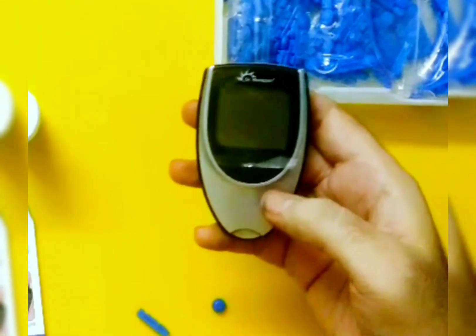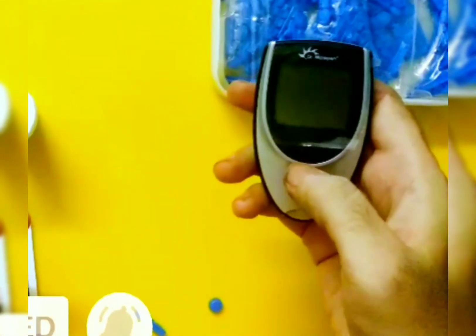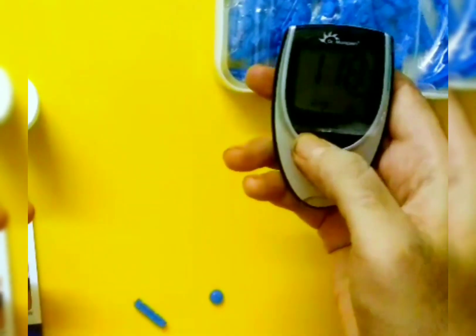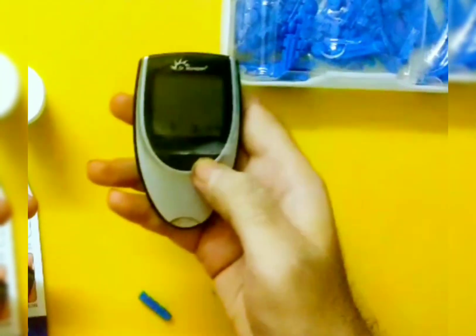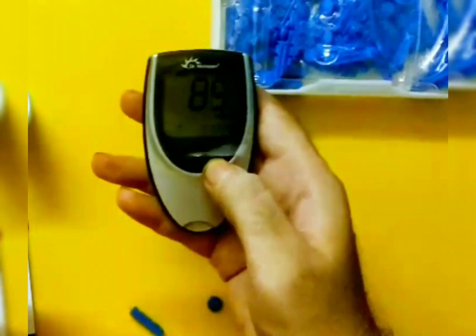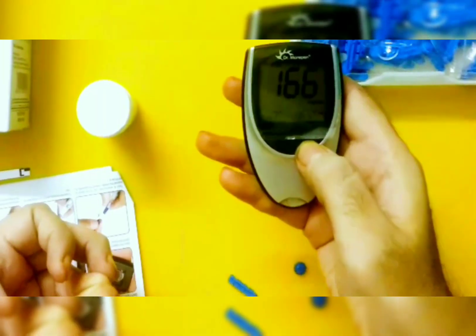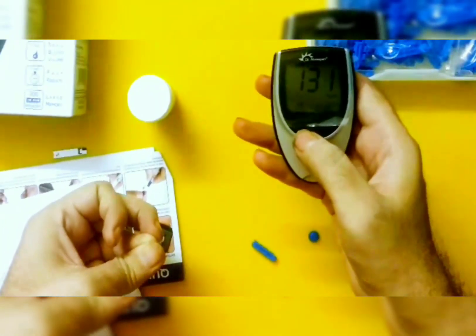We can refer to these results later on also. If I just press the memory button, it will show me the results: 118, 112 — that was the one I recently did — 95, 89, 119. As I said, it can store 300 results, so I'll keep getting whatever test results I've done.